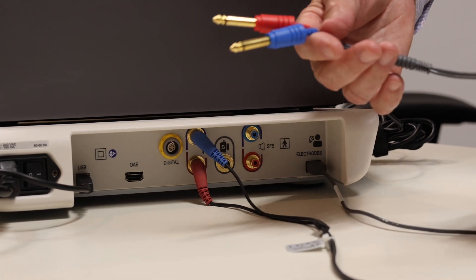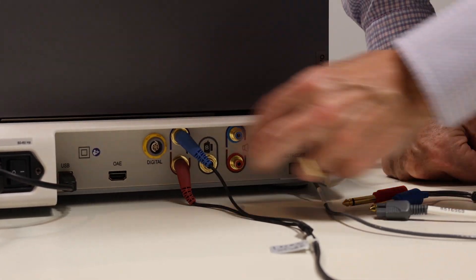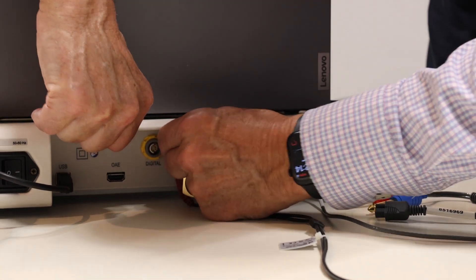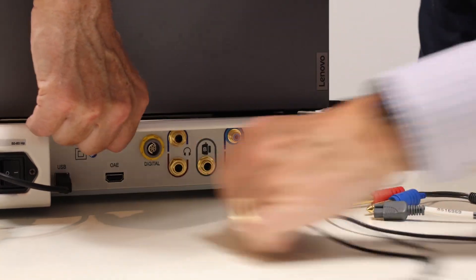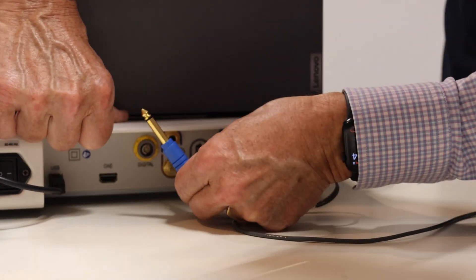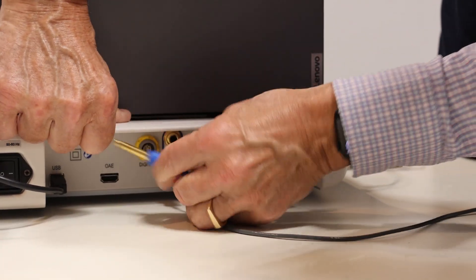The loopback cable, which is a hardware test cable, will plug into the air conduction transducer outputs on the back of the Audera Pro box. So right to right, left to left.